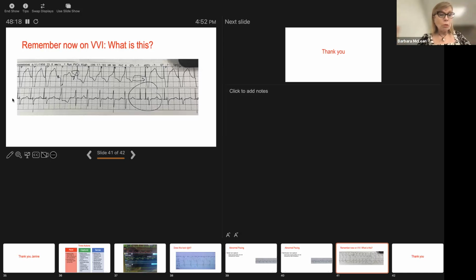It may be totally harmless, but I can only rely on EP to tell me because I can't look at the pacemaker settings. So when I see this, is that a ventricular fire followed by another ventricular fire with the pause? Is that an atrial fire and a ventricular pace? I don't know. I know that the pacemaker is supposed to be VVI. And during these periods, the patient drops his blood pressure. Each time this happens, and it happens pretty frequently during the day. So this is quite concerning.